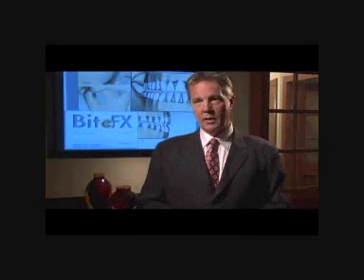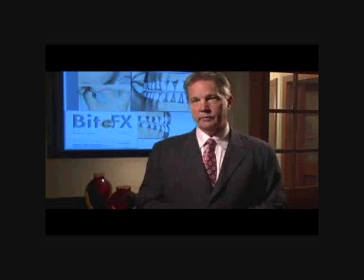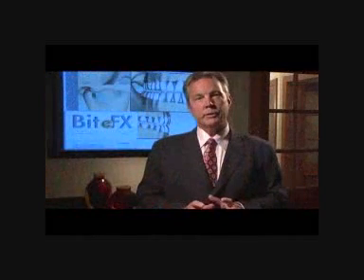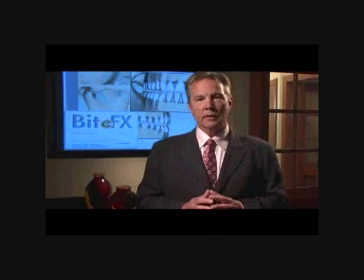So you might be asking, when do I use BiteFX? Sometimes I use BiteFX before I examine a patient. If a patient's filled out an information form and it says that their muscles are sore, their teeth are grinding, I'll use BiteFX as a visual tool to help them see the type of examination I do, to help them see what constitutes bruxing three-dimensionally.